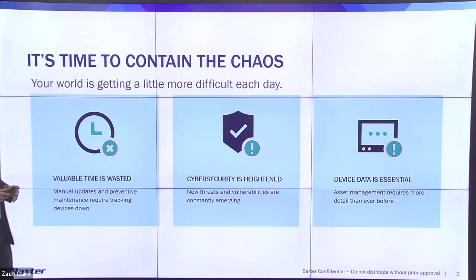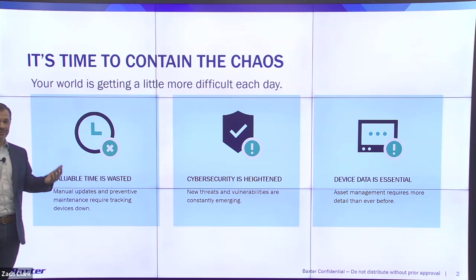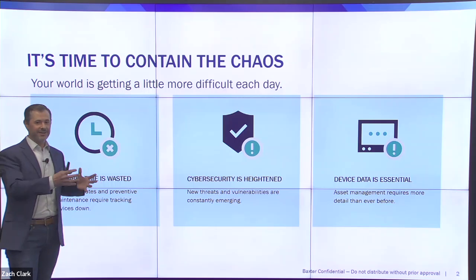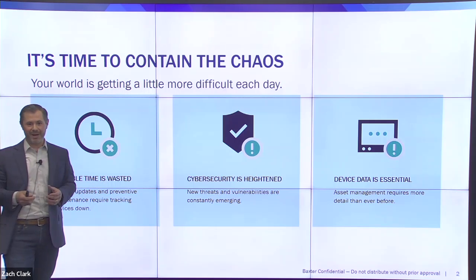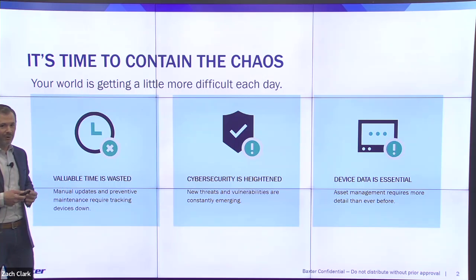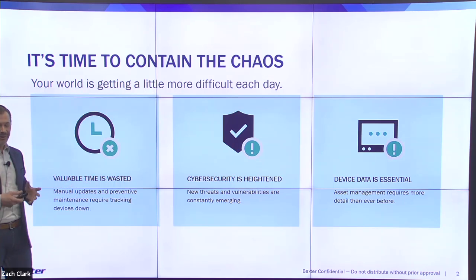First of all, obviously these devices are mobile. They're used throughout the hospital. In some cases, they're used in clinics. And oftentimes, addressing updates or enhancements to those devices does in fact require physically getting the device and either bringing it back to the biomed shop or addressing that update, potentially on the clinical floor. So it requires that individual to go out, get the device, and handle that, which takes time, and it takes some digging as far as locating where that device actually is throughout your facility. So that's a challenge, right?